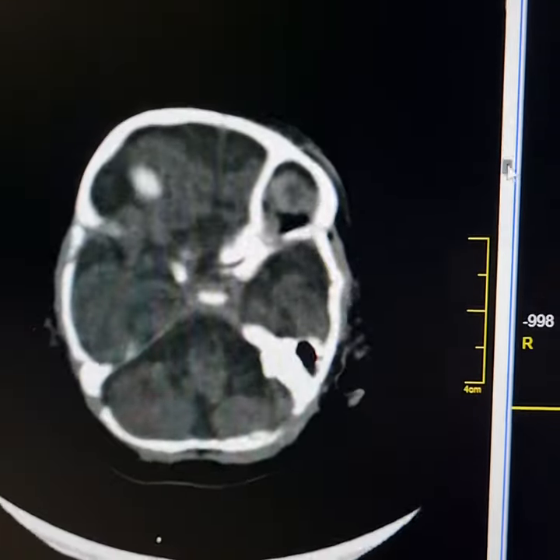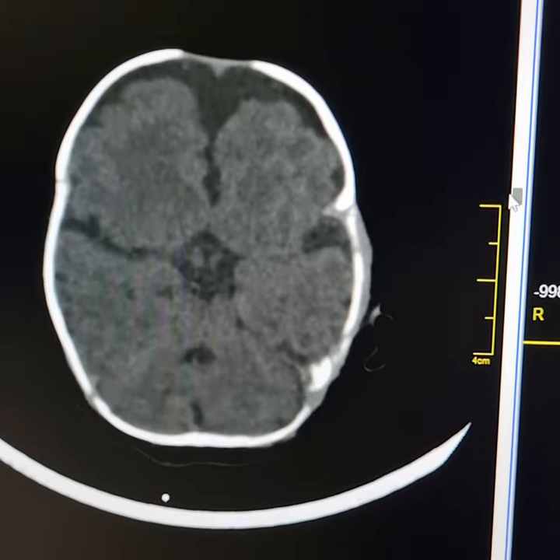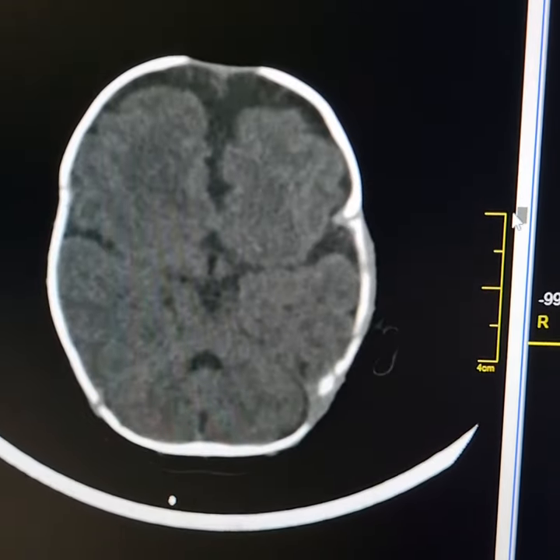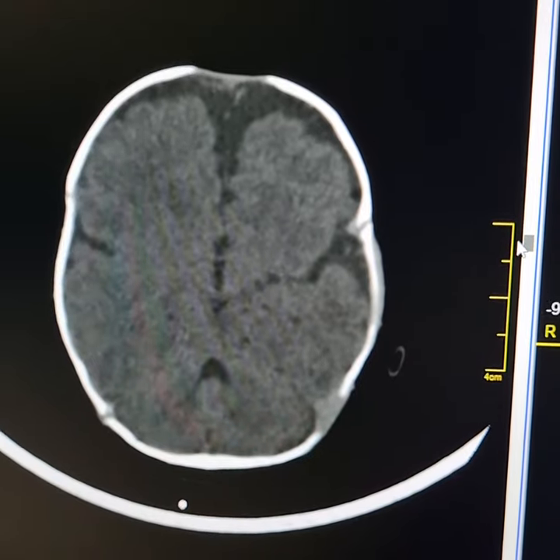This is a plain CT scan of a 3-month-old female baby. There is agenesis of corpus callosum.